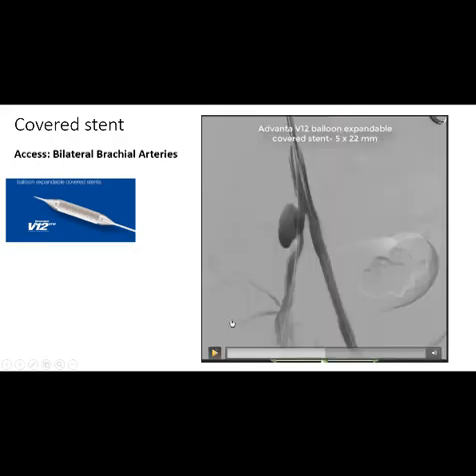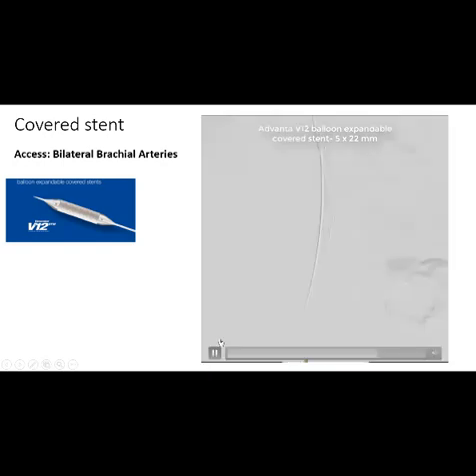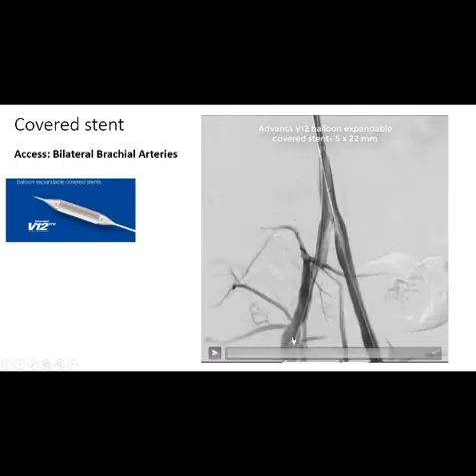As seen on the video, we placed a balloon to protect the common iliac artery, and we deployed a covered stent — a V12 balloon-expandable covered stent, 5 mm diameter and 22 mm length — just at the ostial portion of the internal iliac artery. After inflation of the stent, we were able to resolve the aneurysm without compromising the common iliac or external iliac artery.